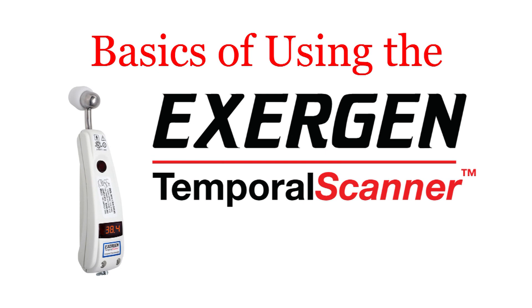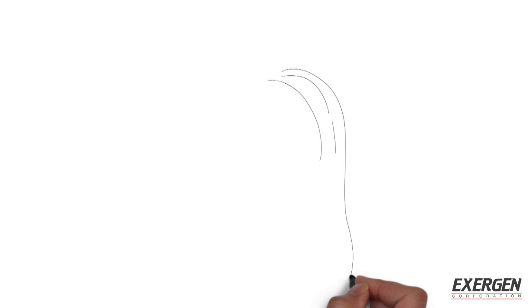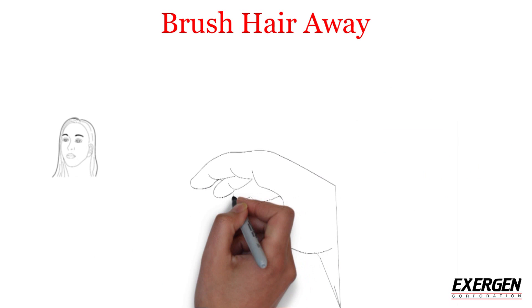These are the basics of using the Exergen temporal scanner thermometer. In order to get the best reading, please use the following directions: brush any hair away from the forehead and ear, and place the scanner probe flush on the forehead.